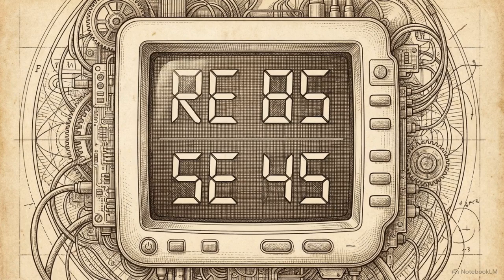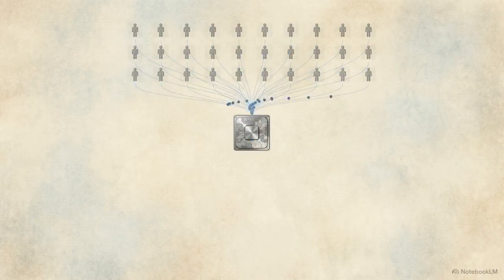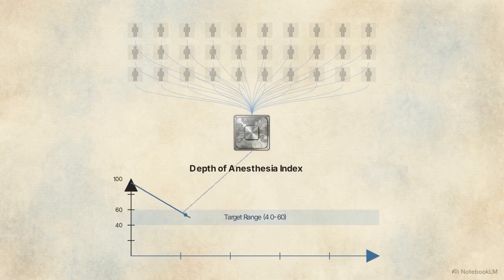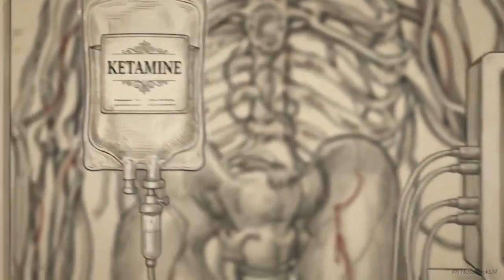If the response entropy number rises significantly above state entropy, the monitor is detecting frontalis muscle activity before a return of cortical activity, providing a crucial early warning of inadequate analgesia. Although these algorithms provide a consistent method for interpreting EEG data, they remain statistical proxies derived from healthy volunteer databases. They possess specific pharmacological blind spots.